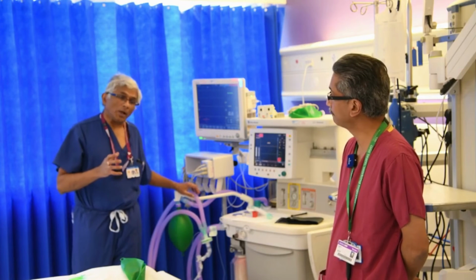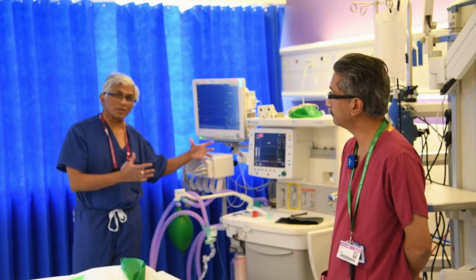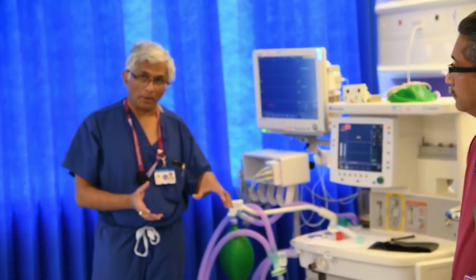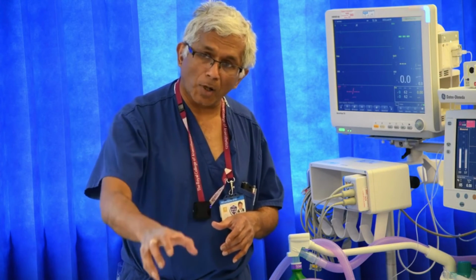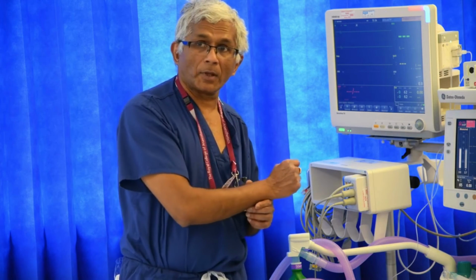If I summarize, the most important thing when you come for the shift is to get familiarized with the patients, how much oxygen the patient is on, and any issues with the ventilation. If the nurse says there are some changes, you can act on that. Most importantly, do not panic and go by system. You can check from the mouth, the connection, going back to the breathing machine and see whether there's any obvious fault.